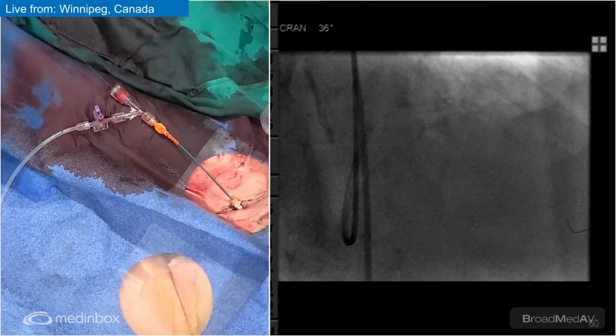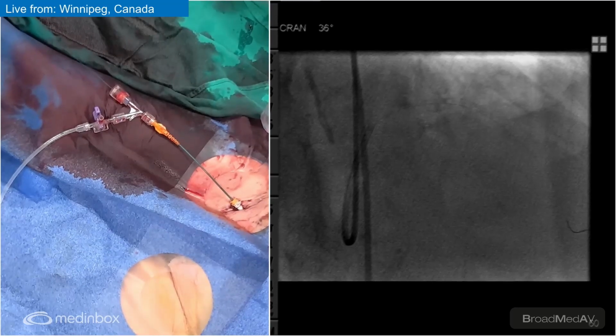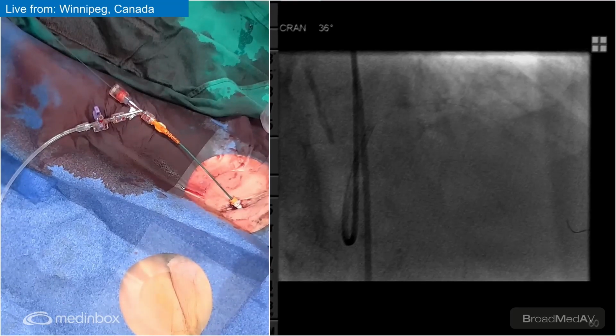And you have lesion going down to the ostium, as you mentioned there. Should we do a caudal view just to see? But on the previous angio, it looked okay. Even our OCT looks pretty good. Right. So I'm assuming it's probably 16 millimeters. You want to measure the length of the lesion? How long of a stent, if we're going to get to it?